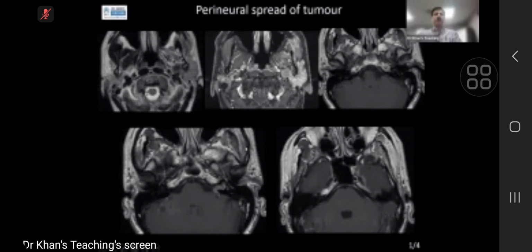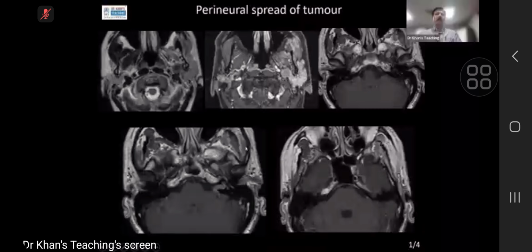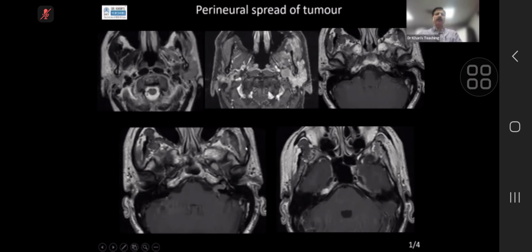This patient came to our hospital since 2 years with facial nerve paralysis on the left side. And the imaging which was done was CT temporal bone. Many a times MR was done by the neurologist. But the key point which everybody forgot, that adequate imaging was not done. Parotid, because parotid lesions can also cause facial nerve paralysis.